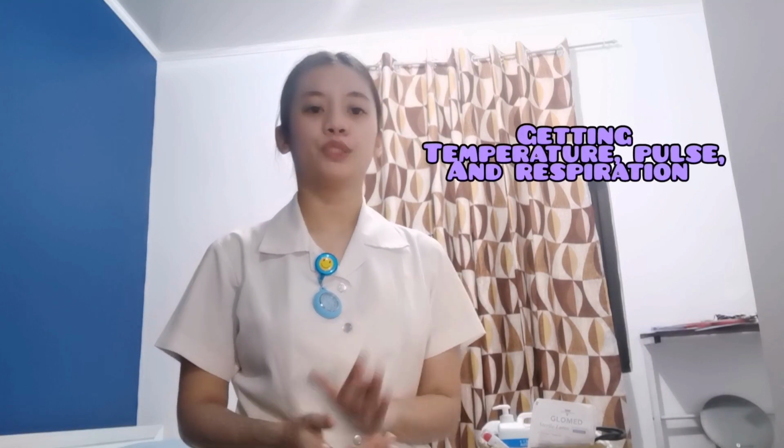After implementation, we will now go into getting the temperature. First is to obtain the thermometer for temporal, axillary, or rectal, and then wipe with cotton balls in a circular motion from bulb to stem.